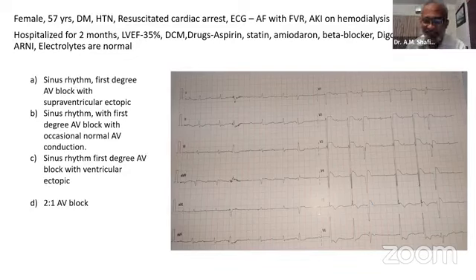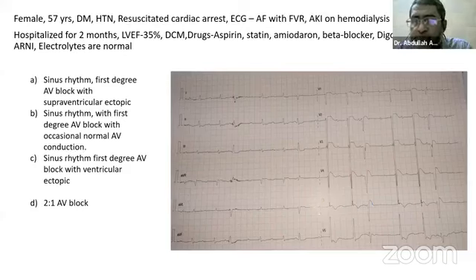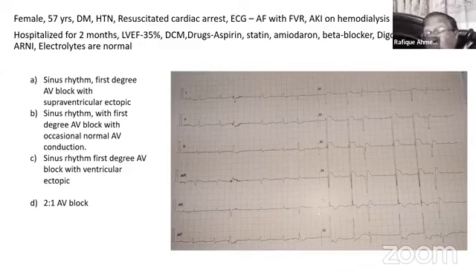if you look at the 12-lead ECG, V1, V2, V3, the R wave is small initially, right? Yes, sir. So there's poor R wave progression, or the lead position is not in the right place, one or the other. But of course, Jamie's point is well taken: how come this is not fitting in with the typical description of bundle branch block? And it's not. It is probably better described as non-specific interventricular conduction delay. But my bet is with this.